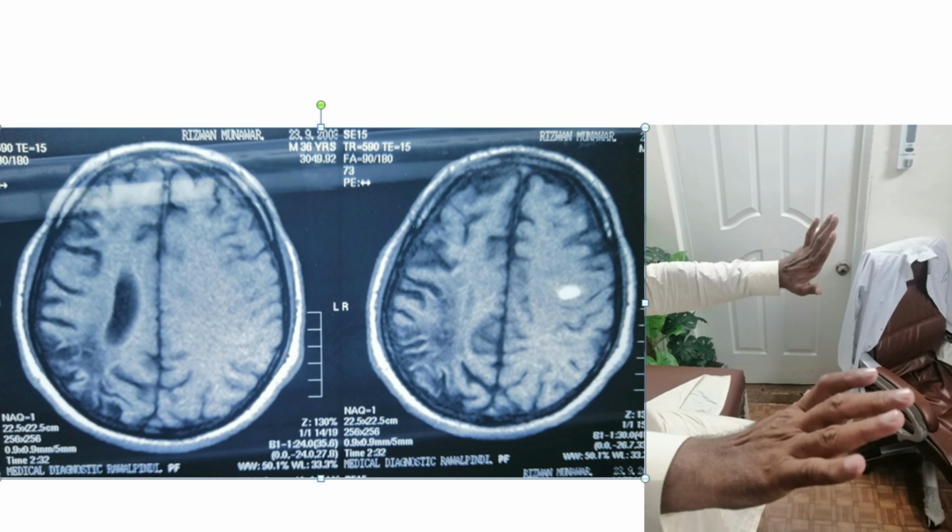So this patient had a road traffic accident in the past, more than 20 years ago. And his scan, if you look at the time, was a long time ago, 2006. I said, I don't need to repeat the scan, just bring your old scan. I just want to make sure what happened at that time. And he had dystonia clinically. Again, correlation helps in terms of management. In his own words, his symptoms are 70% better after 20 years of seeing different doctors. And to me, this is artifactual. Or there could be some other hyperintensity. You have a better diagnosis on the T1 scans. So we know manganese and other stuff can give you signals.